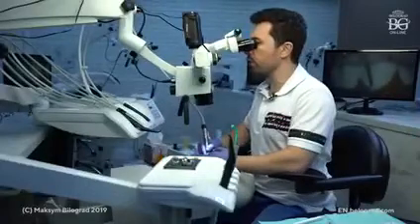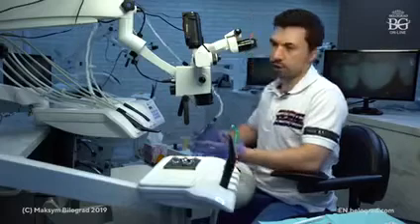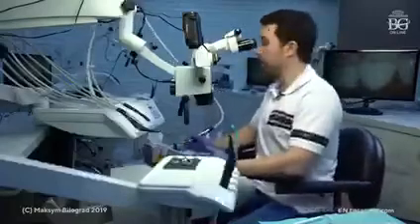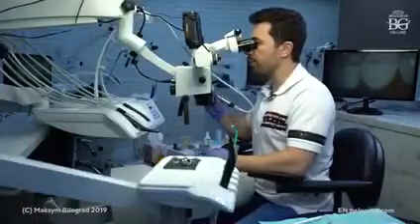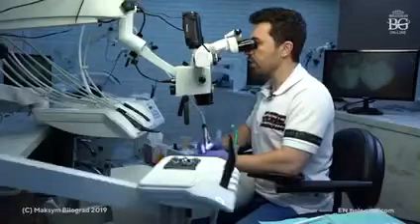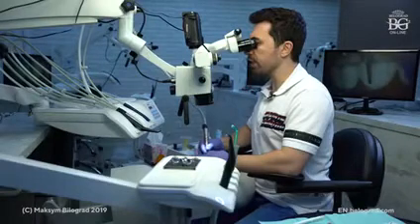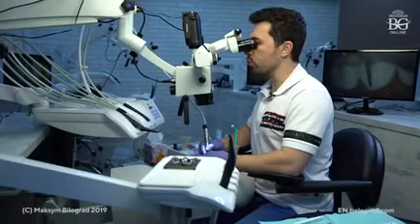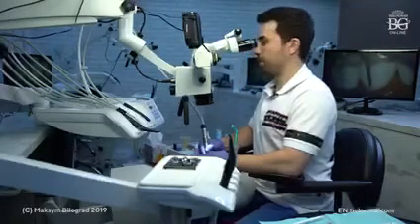Okay, I will just move my finish line a little bit more down, but still I will keep it supragingival just for this educational purpose, for you to be able to see what actually I'm doing.